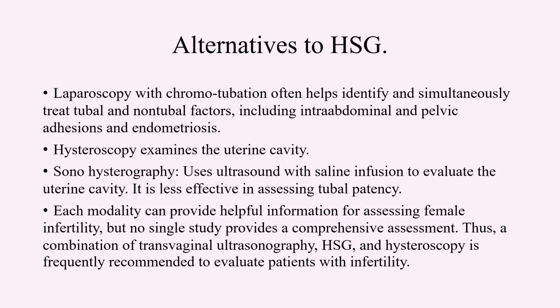Each modality can provide helpful information for assessment of female infertility, but no single study can provide a comprehensive assessment. Thus, a combination of transvaginal ultrasonography, hysterosalpingography, and hysterography or hysteroscopy is required and frequently recommended to evaluate patients with infertility.